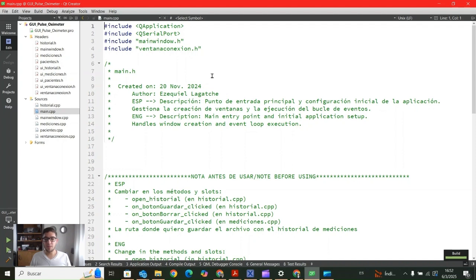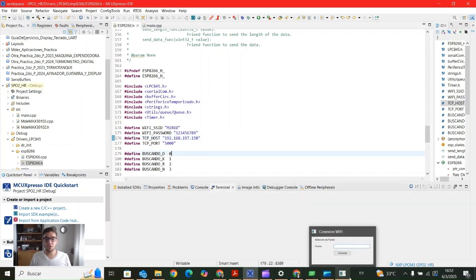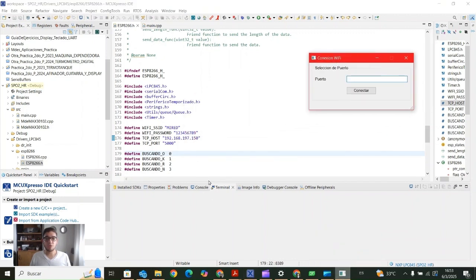Once it has been compiled, now we are going to run it. While it's being run, we're going to go to MCUXpresso IDE, and we are going to look for the new window opened when clicking on play in Qt Creator. When we are in this window, we are going to try to have these two windows at the same time: the workspace window in the IDE and the window itself of the graphic user interface.